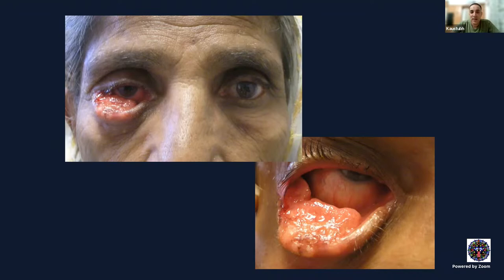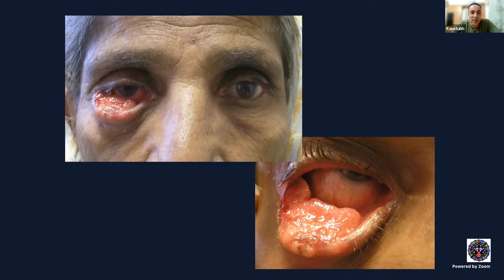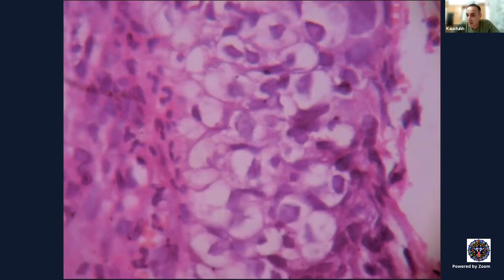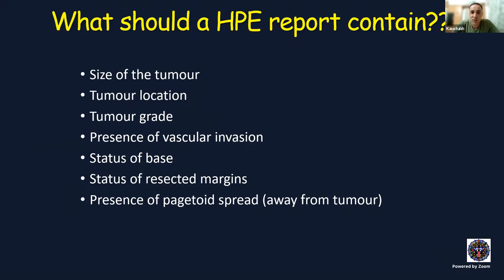Now for commonly encountered ocular oncology lesions. This elderly lady presented with a lower eyelid fungating, cauliflower-like fleshy growth on the palpebral side — this is sebaceous carcinoma. Histologically, it appears as an infiltrative lobular tumor with central necrosis and characteristically clear cells, because they contain fat which dissolves during alcohol processing, leaving empty-appearing vacuoles.